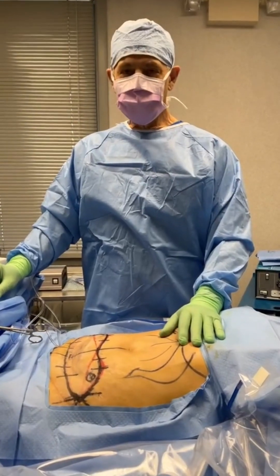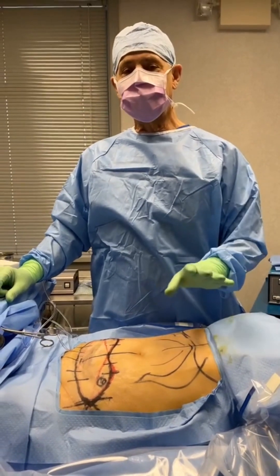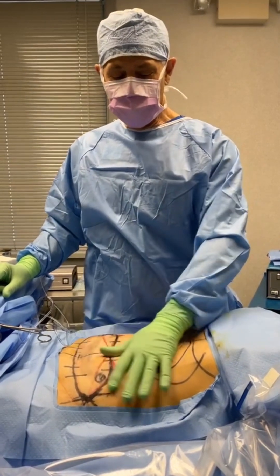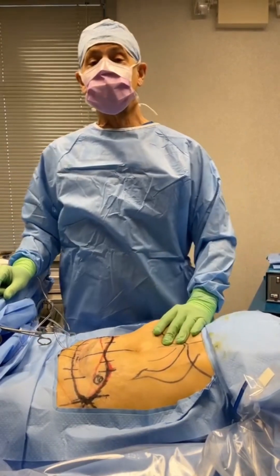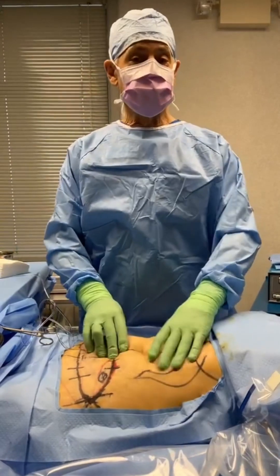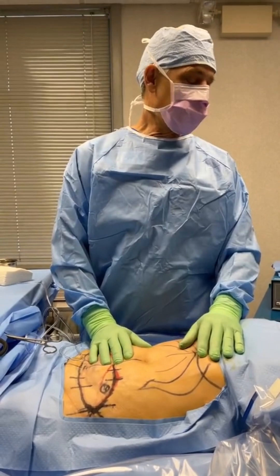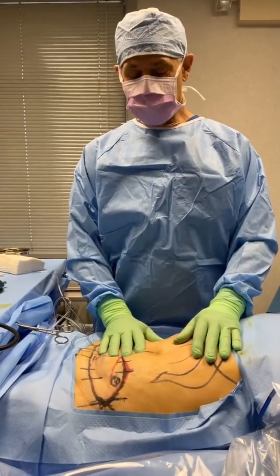Good morning, Milford M.D. This morning's project is lipoabdominoplasty, which means we're going to use VASER to bounce fat cells off where they're adherent in our patient's abdomen. She's awake and going to stay comfortable during the procedure — she may fall asleep, but she's going to be comfortable.